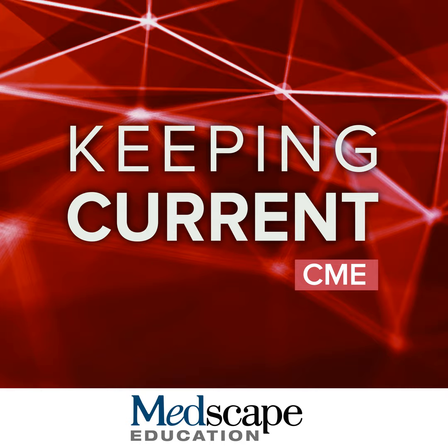And for me, and I tell all our fellows and residents, when you're looking for neuroendocrine metastatic disease, to use gadoxetic acid, because the hepatobiliary phase, I think, very strongly helps in finding these metastases. So here's a sub-centimeter metastasis best seen on the hepatobiliary phase.